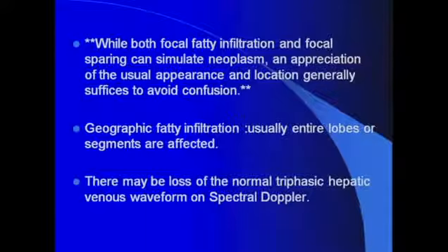Now, this confusion can be averted if you supplement your study by color or power Doppler. Look at the vascular structures coursing through that area of increased or decreased echogenicity, in other words, fatty sparing or fatty infiltration. If you don't see any splaying or distortion to the course of these vessels, it means this is most likely a focal fatty sparing or focal fatty infiltration, depending on the echogenicity.